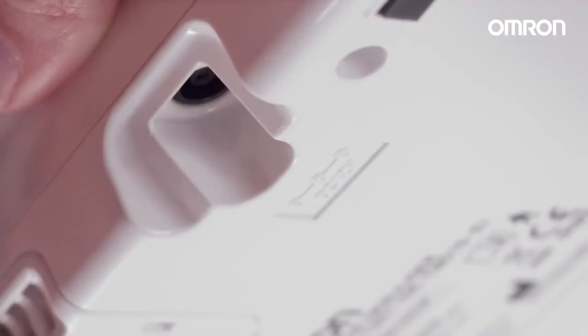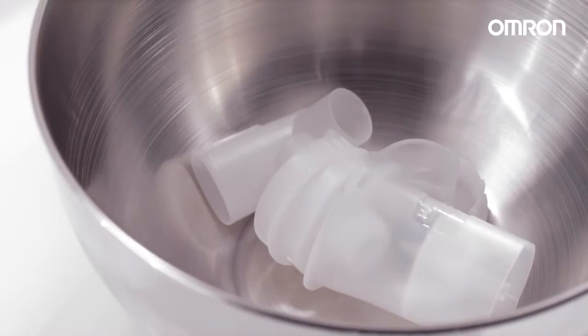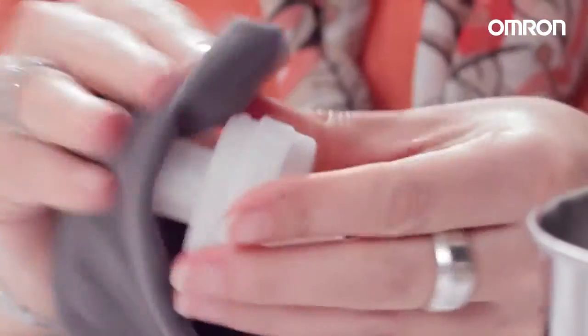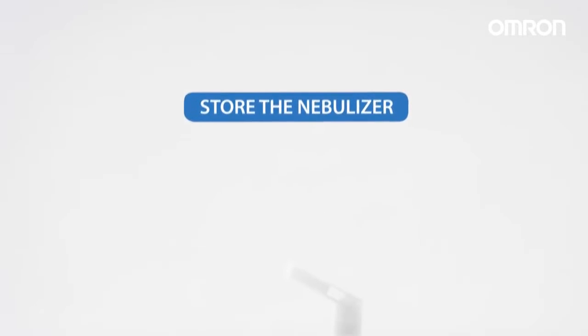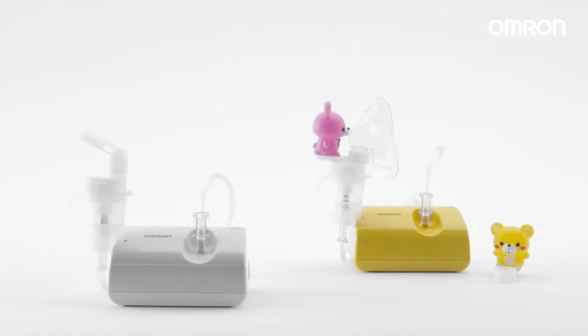Check that there is no condensation or moisture in the air tube and unplug the device. Thoroughly rinse the nebulizer kit and all accessories with clean hot tap water after each use, and disinfect them after the last treatment of the day. Reassemble the nebulizer kit and put it in the storage bag. Make sure that the air filter is changed regularly every 60 days.